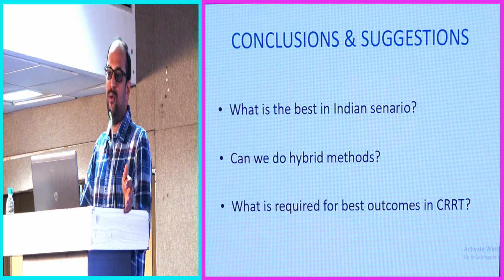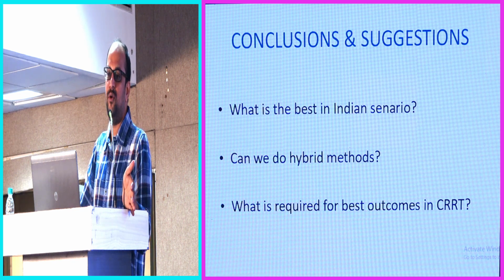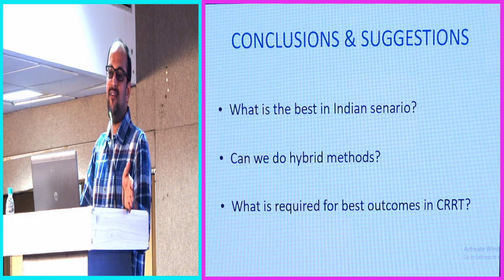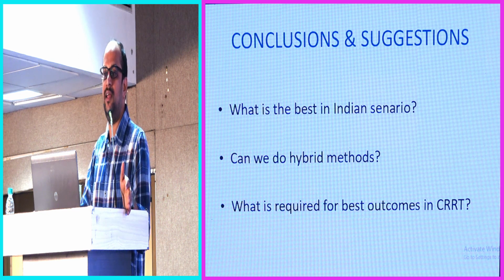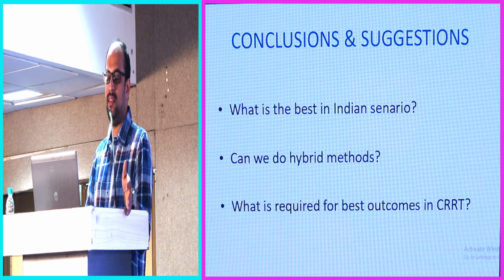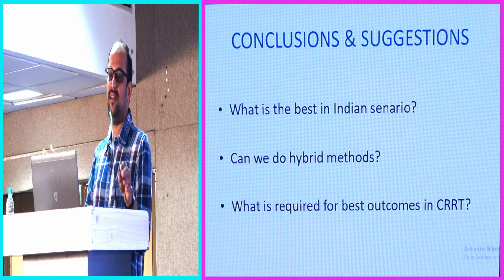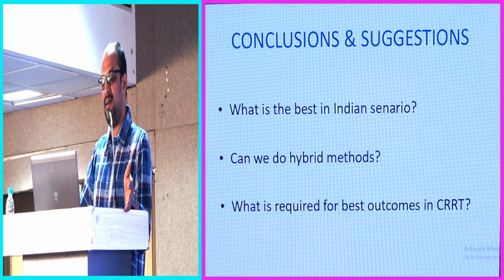So in this scenario, I will start without any anticoagulation at midnight, 2 o'clock, because I cannot take calls every day, and only one technician will be available at night time. He will be hesitant to start citrate anticoagulation because he is not aware of the patient's clinical status. So I will buy some 6 or 7 hours. By the time I reach the hospital at 8 o'clock, I will have run the circuit without any anticoagulation. Then, with the same filter, I just change the bags from normal Prismaflex bags to citrate bags and run the circuit.